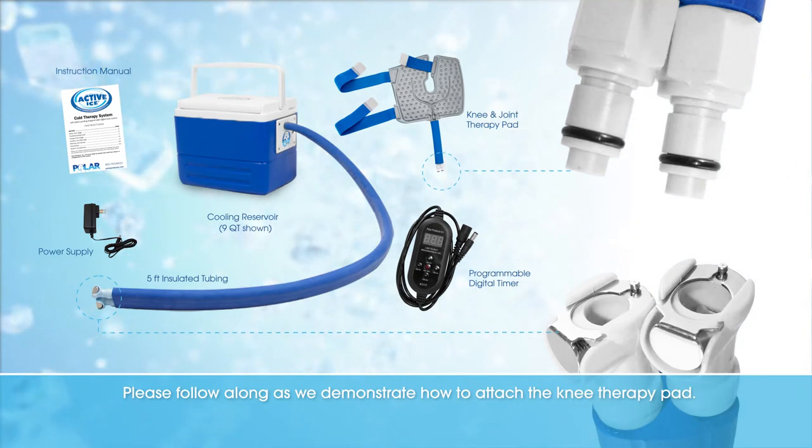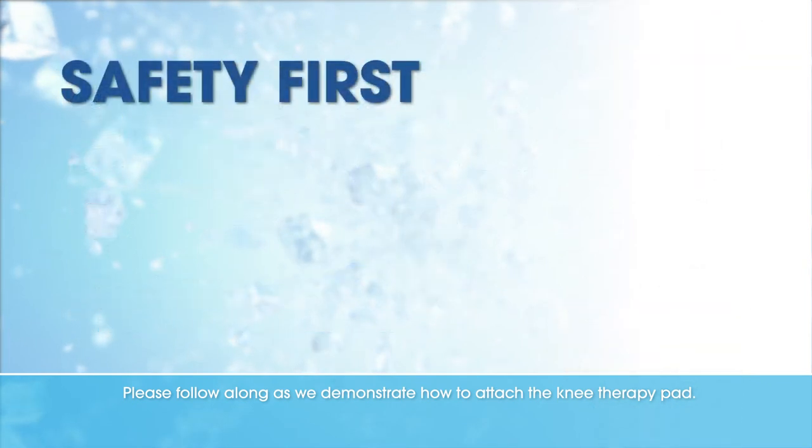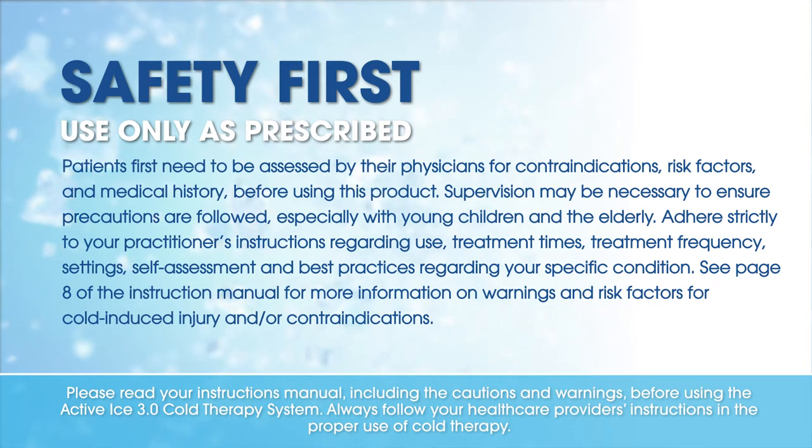Please follow along as we demonstrate how to attach the knee therapy pad. Please read your instruction manual, including the cautions and warnings, before using the Active Ice 3.0 cold therapy system. Always follow your healthcare provider's instructions in the proper use of cold therapy.